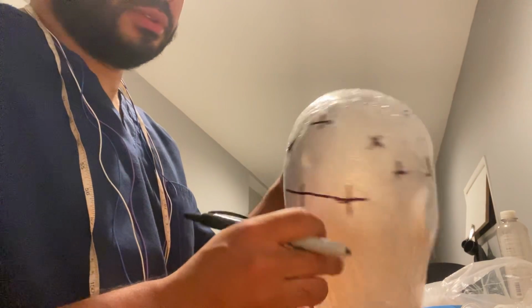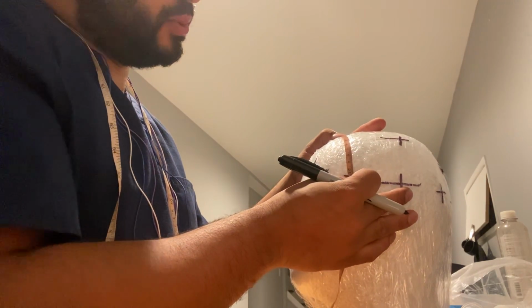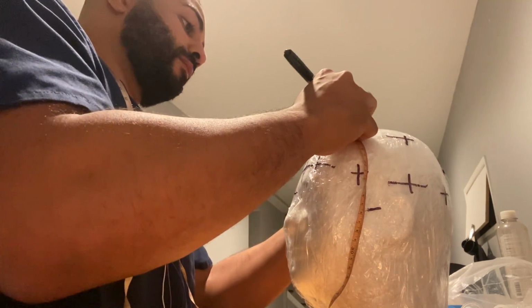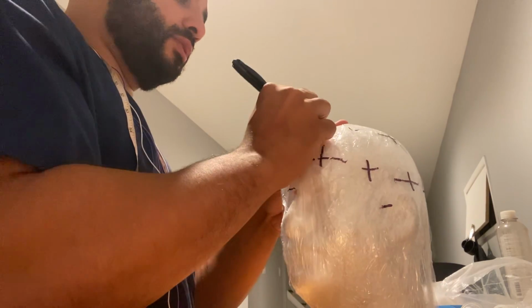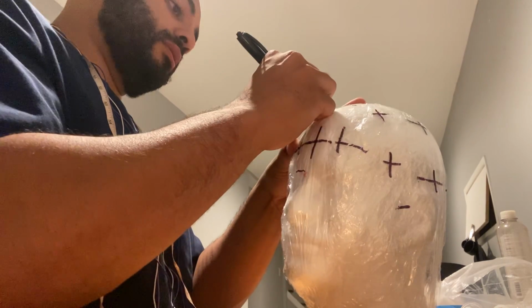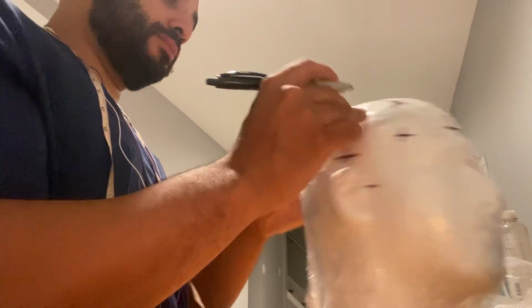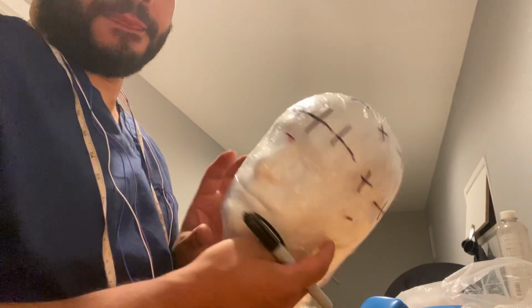Posterior coronal, same thing here as the anterior coronal. I'm going to go through, I get 20 even, so I'm going to go 15, 10, and 5. I'm going to finish up my X's, cross them over where they intersect. Make it nice and clean. Cross these over. That's my measurement.